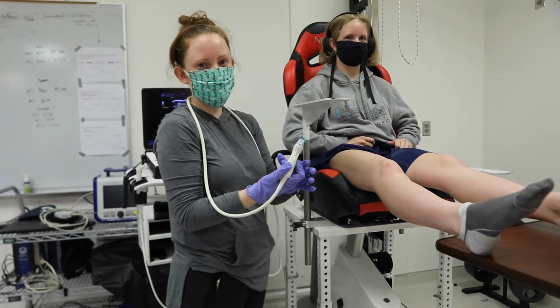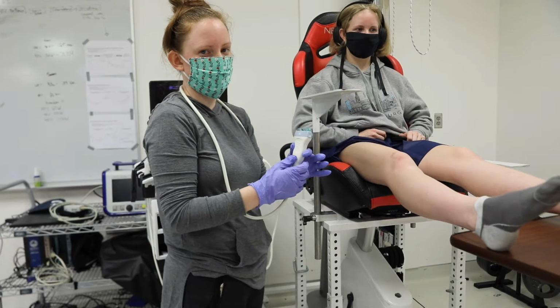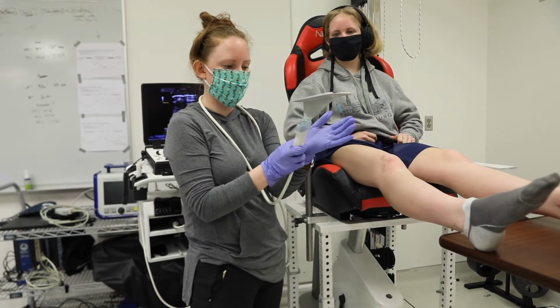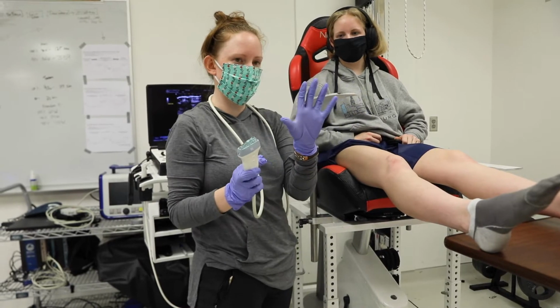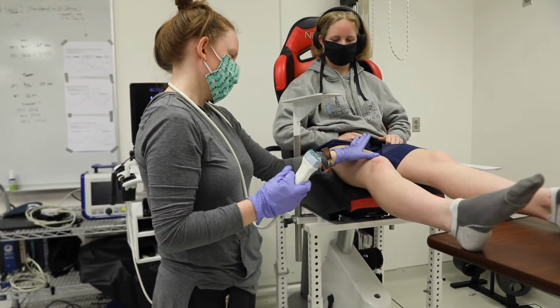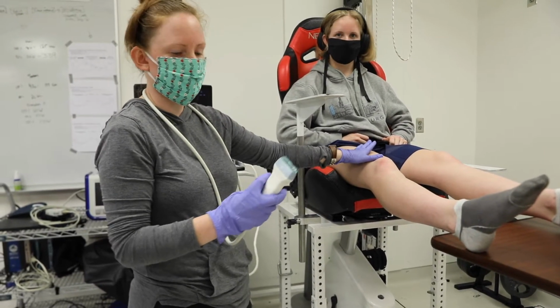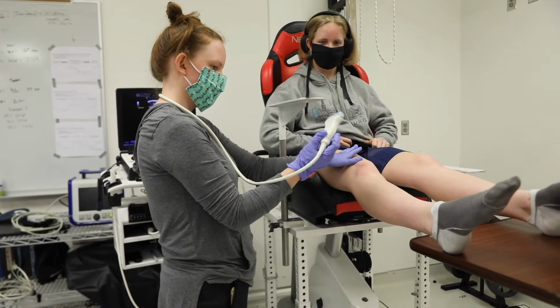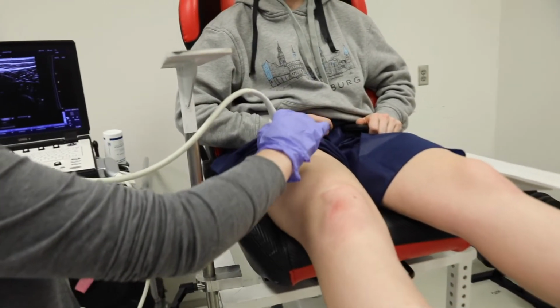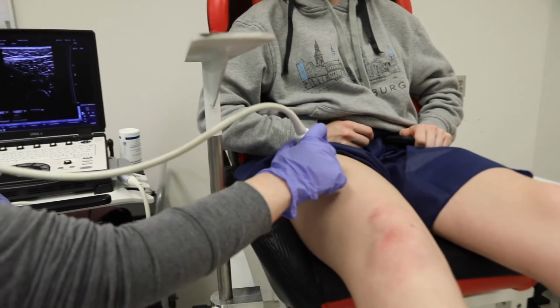So to be able to use the NIRS, you first need to be able to find the vastus lateralis muscle on the subject. To do that, I use a hand length. From my thumb to my pinky, start at the top of their patella and stretch out to about your pinky off to the lateral side of their leg. Use the probe and put it where your pinky is. And usually right around there is the vastus lateralis.